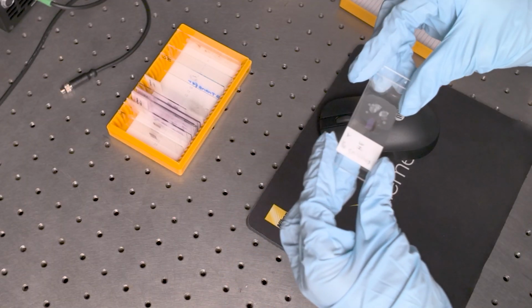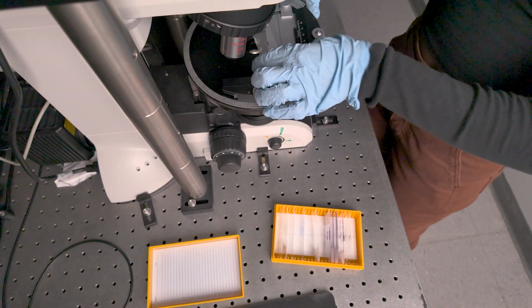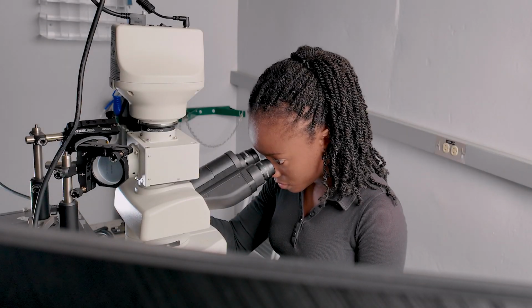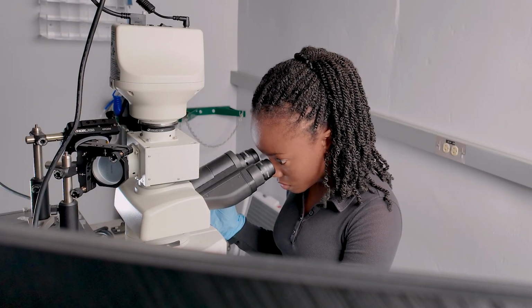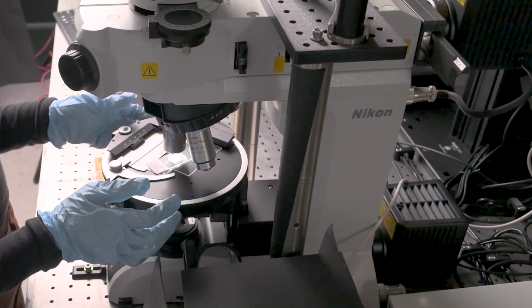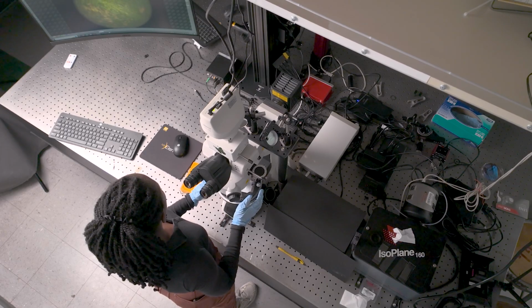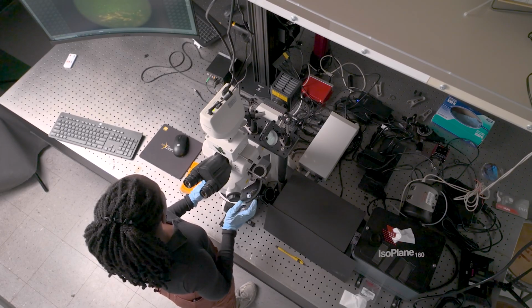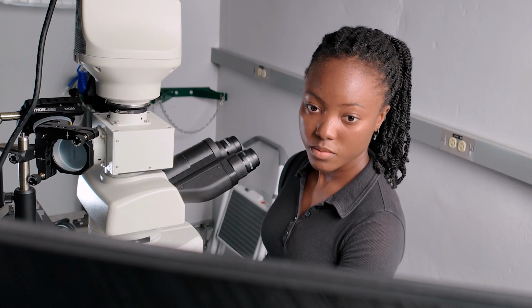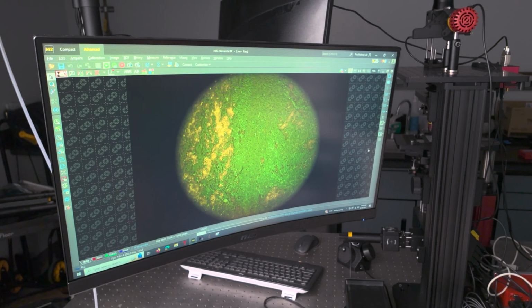There's a lot of things that go into diagnosing cancer, and one of the main things is looking at collagen arrangement. So what this method could help you distinguish is collagen arrangement itself, and that is a tool a pathologist would use for determining cancer stage. So this expedites the process and makes it easier and more accessible because you don't have to do any chemical staining or use a super powerful optical component.